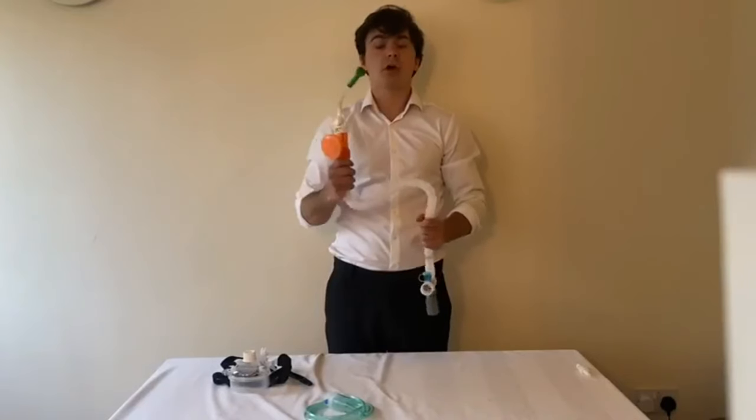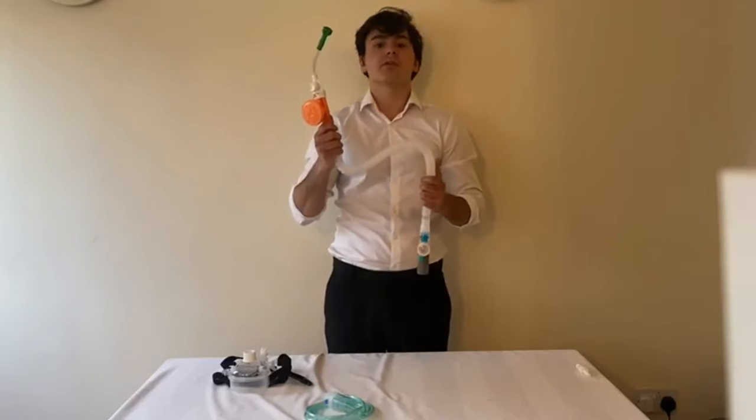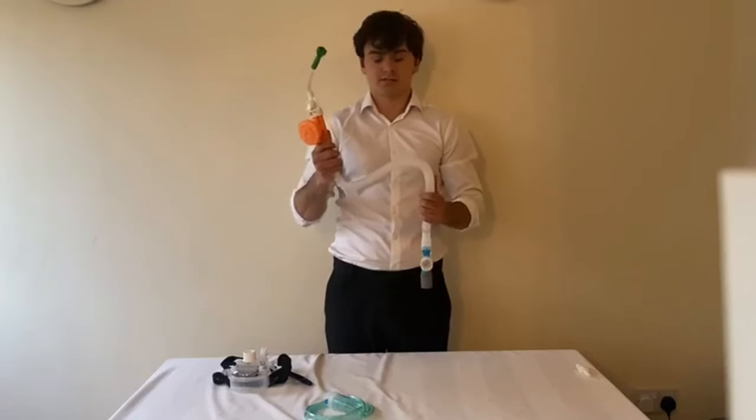The extendable tubing will open out to over 6 feet in length. During therapy, ensure the flow isn't being disrupted by any twists or obstructions.